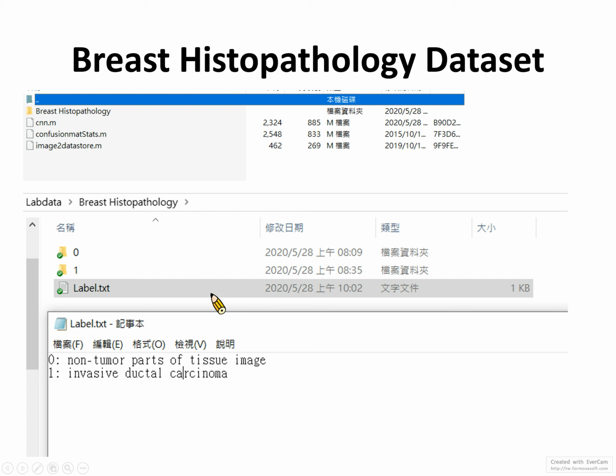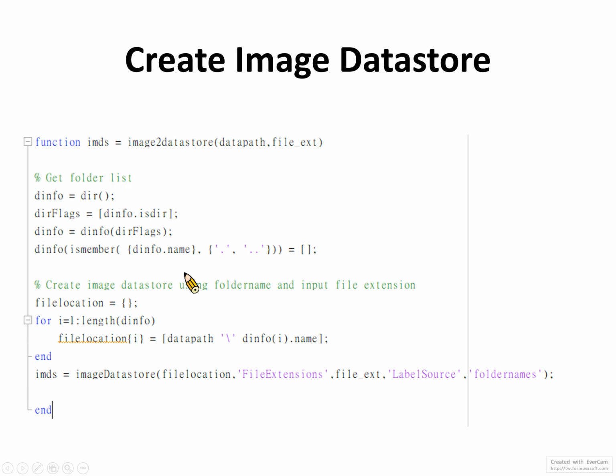We don't want a folder that contains everything when we don't know which item has which label. So in this case, for AI-ready data sets, you need to put everything under a specific label so you can use computer code to read this label. For this code, we need to get the folder list, and each folder is actually a label.